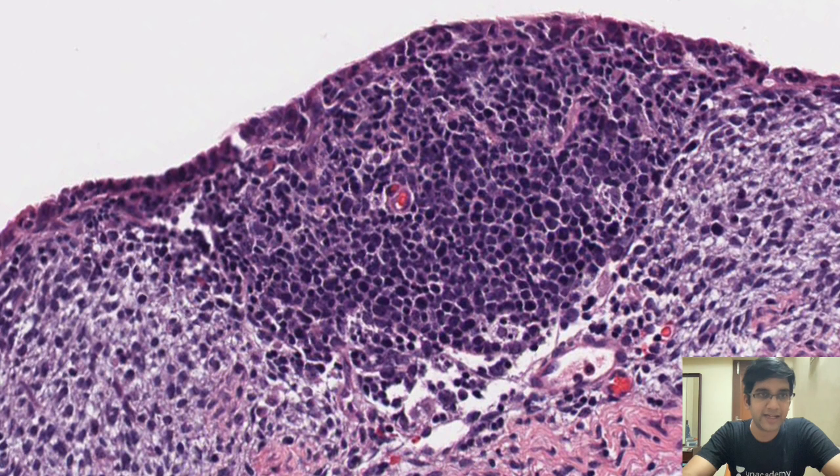Here again, you can see the perfect mesothelial lining on the top, right? And below that I have lots of condensed cells. It is not more spindly, it's more of small round blue cells, right? So a 10-year-old kid with a small round blue cell lesion in the pleural space. I have a few differential diagnoses in mind. I hope you must have also had some DDs in your mind. Just do comment on them.